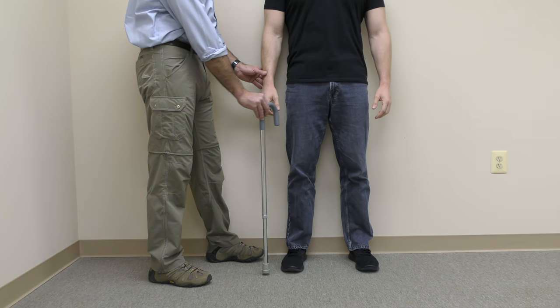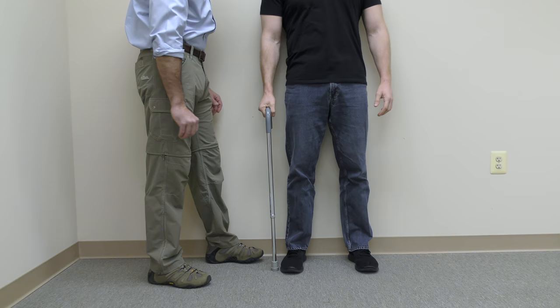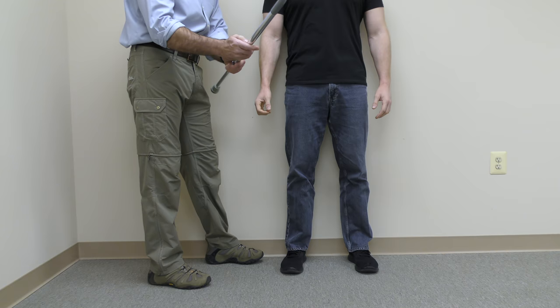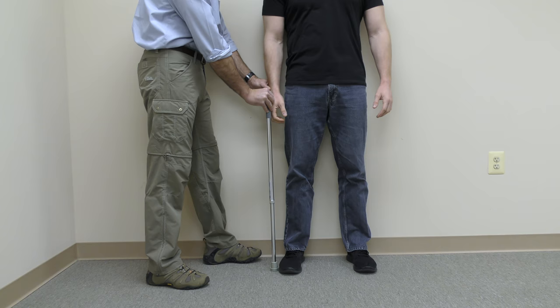Oops, it's now too low. It's not at wrist height, and the elbow should never be straight while holding the cane. Keep adjusting until you get it correct. Now it is at wrist height with a slight bend in the elbow — perfect.